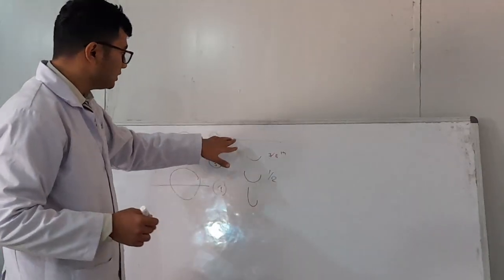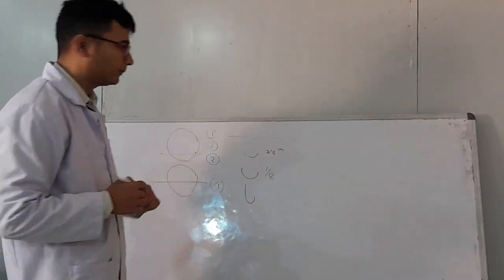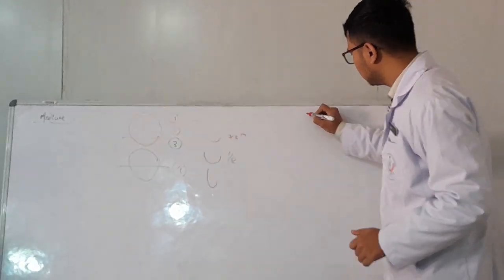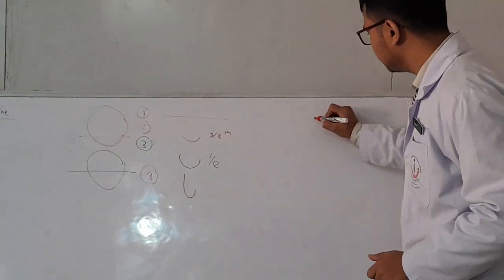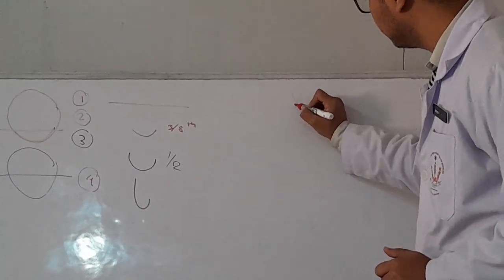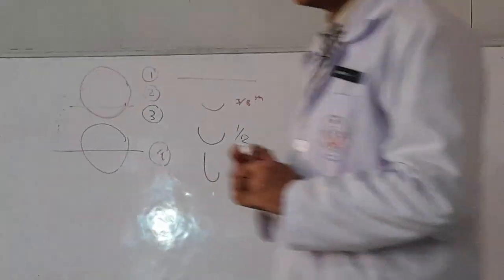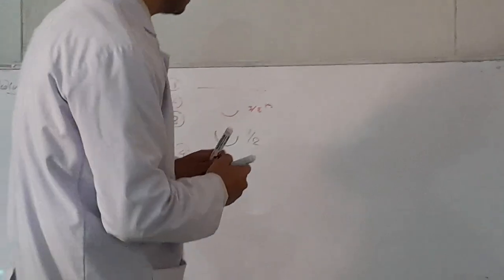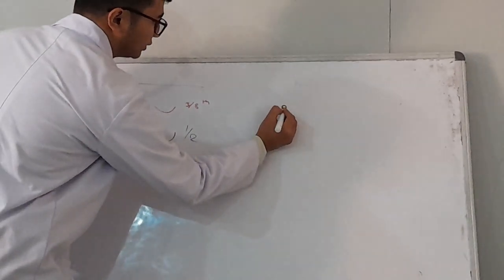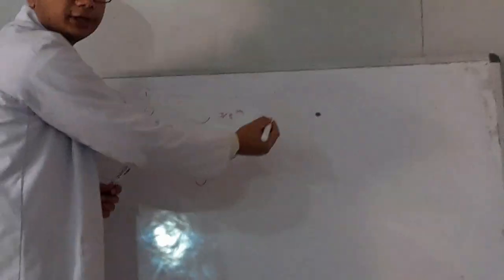Now in this suture needle itself, we will talk about the body of a suture needle. Suppose this is the suture needle, and we take a cross section of it. There are mainly three types of cross section of a suture body. The first one is completely circular in nature, so it has a round body.